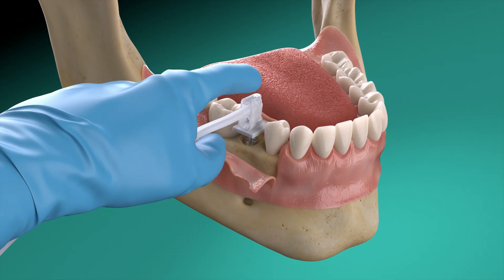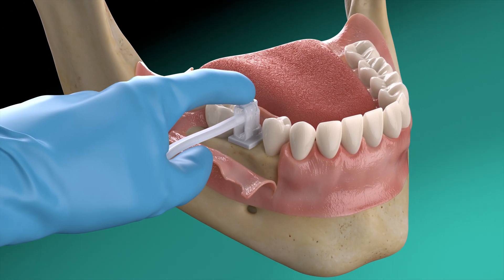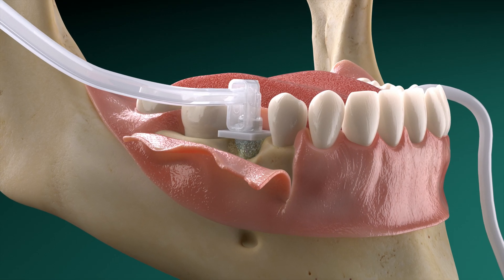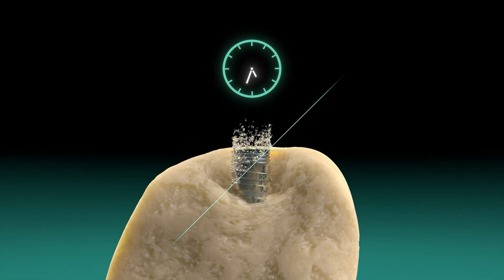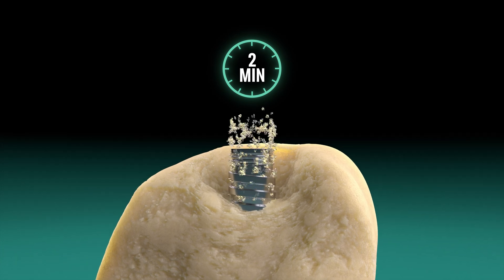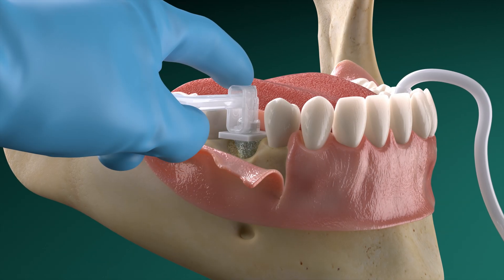Place the Galvosurge spray head against the internal connection of the implant and start the electrolytic cleaning. Galvosurge's cleaning action is visible: hydrogen bubbles form directly underneath the biofilm, lifting it from the implant's surface. Make sure the implant is sufficiently covered by the Galvosurge cleaning solution.